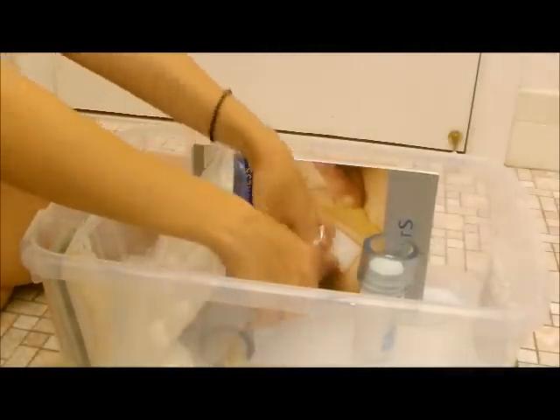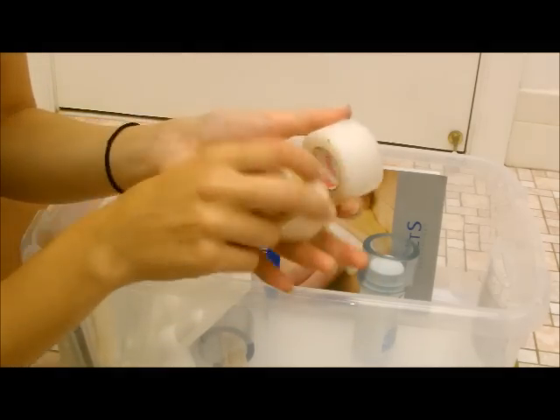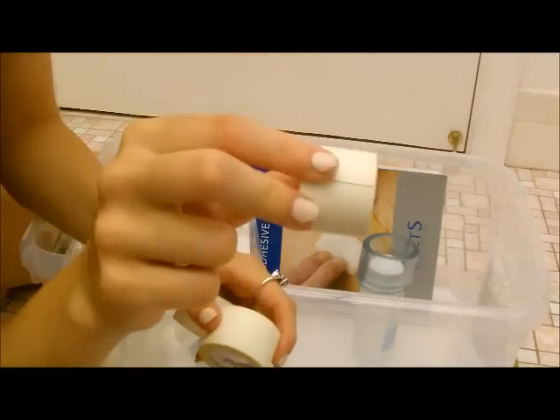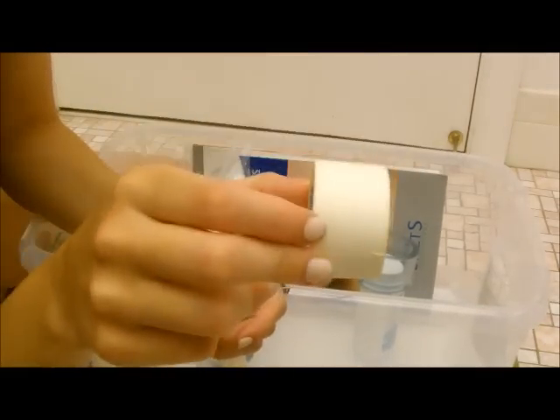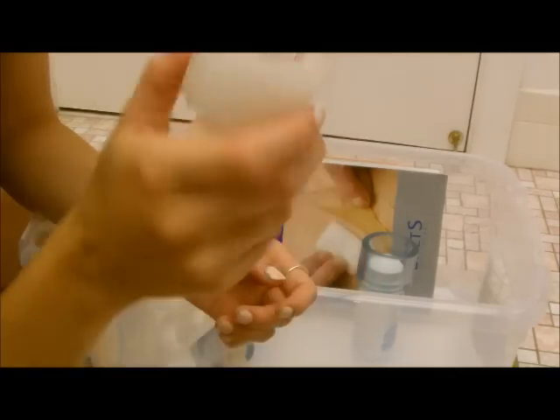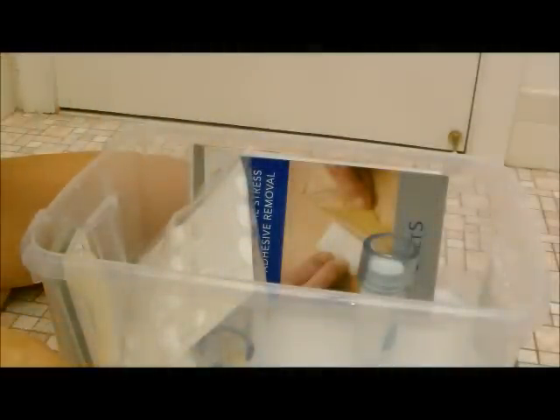What else do I have? I have a collection of tape here. I have three different kinds of tapes because you never know what situation will come up that you need tape. I have fabric tape, I have paper tape, and I have medical tape, which I don't know if there's a name for this, but it's kind of like the perforated, can you see that? I don't know if you can see that, but that's okay. Perforated medical tape, that's what I call it.